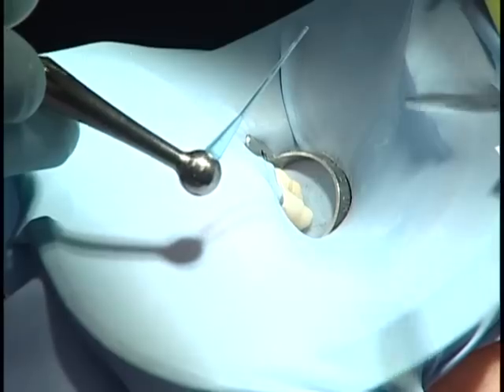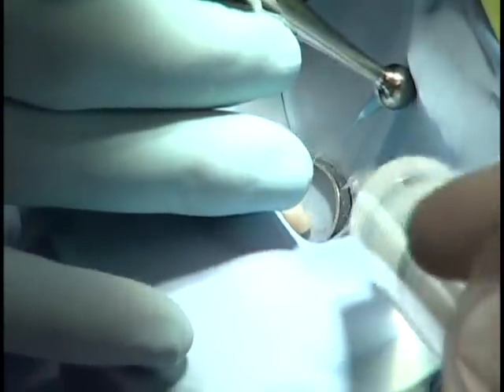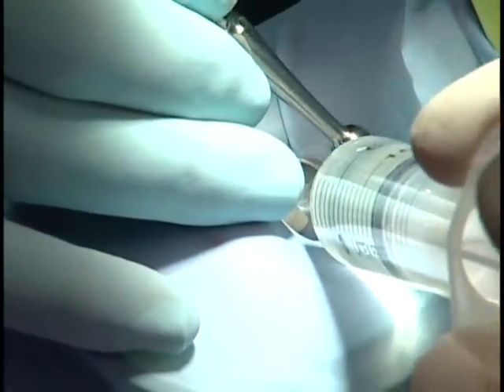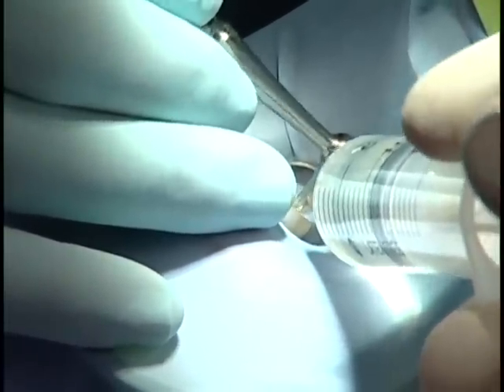Thanks, Jennifer. Go ahead and irrigate at the access with the master delivery tip while I work the macro cannula up and down each of the canals, removing all of the coarse debris. I'm going about 2/3 of the way down the canal, moving up and down, and I'll do this for about 30 seconds in each canal.